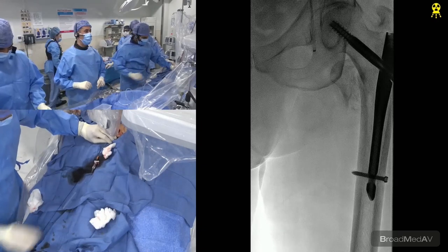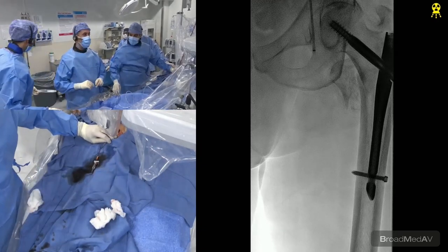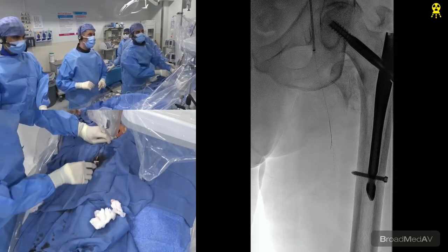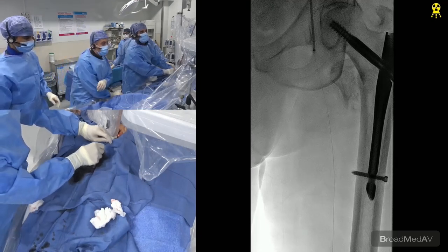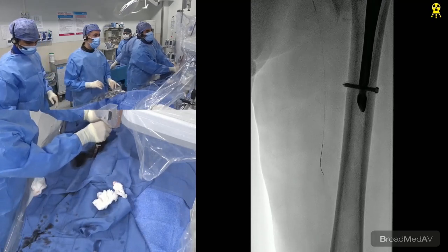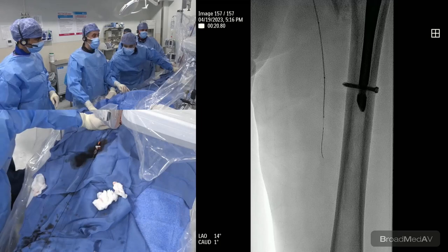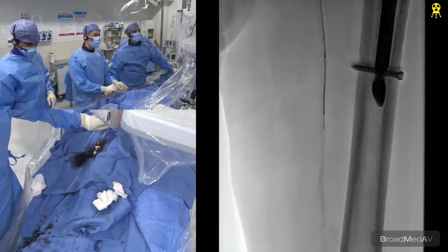Okay, good. So we have an 035 Navi cross here with a Command wire in there, I believe. So we have, when it's stiff, a Command wire to cross. Part of me is kind of hoping that there is a tiny channel there that will make a true intimal crossing much more feasible. So, we'll see how this wire goes.